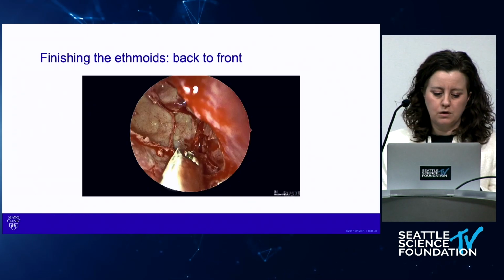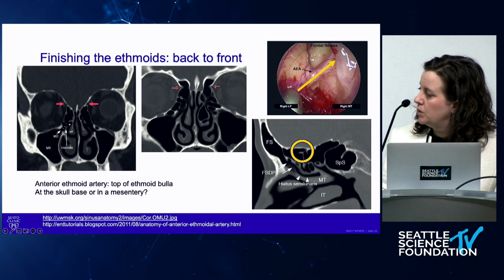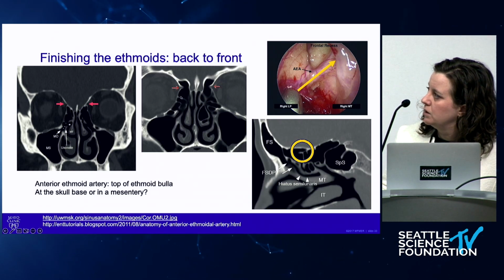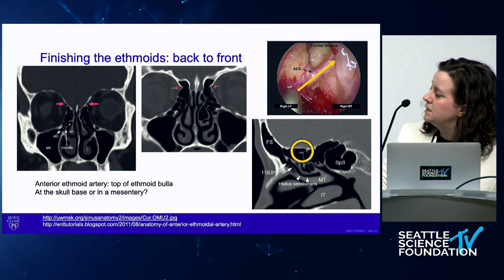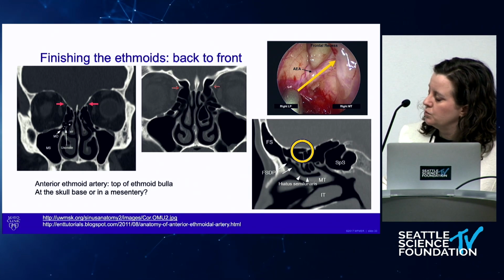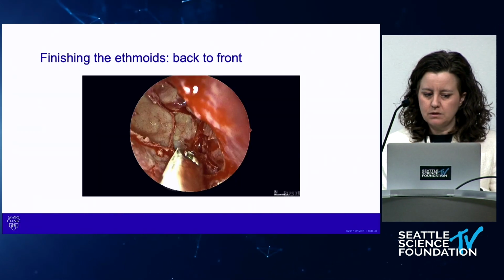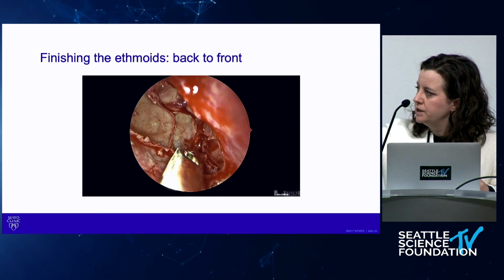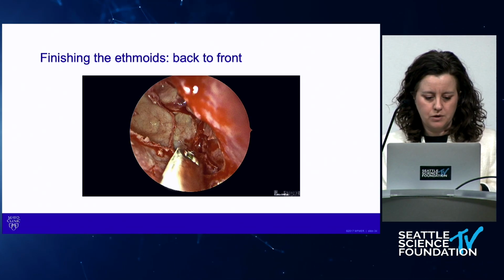I'll just say briefly, we're going to finish the ethmoids going back to front, but things to watch for as we're working on the skull base: the anterior ethmoid artery, look at your scans. Is it at the skull base, or is it in a mesentery? It comes out of the orbit and extends more anterior, so it's at an angle. You can see it on your sagittal view if it's low, so be aware as you're working on the skull base. I will skip the video for time, but once you've got your lamina, you found your skull base posteriorly, you're working back to front. I'll show it in the pro section.